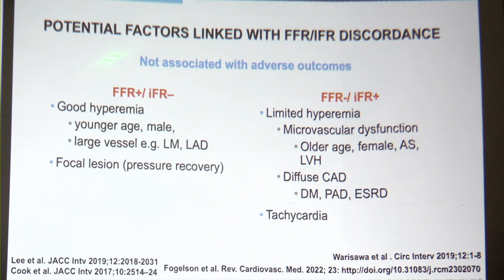What about the other way around? FFR positive, but IFR negative. This happens in patients or individuals who just have really good hyperemia. Young individuals, if you measure it in the left main or LAD, you may get this sort of situation. Or focal lesions. Another phenomenon is pressure recovery.